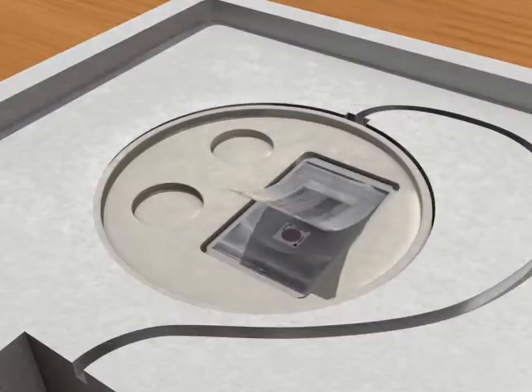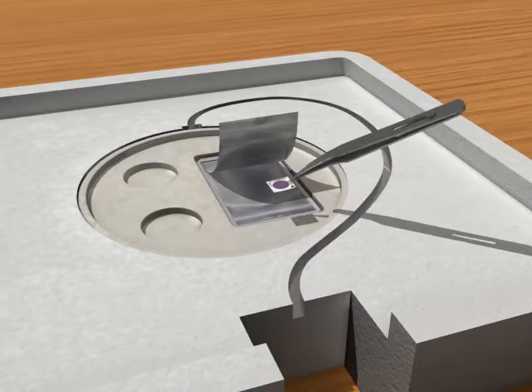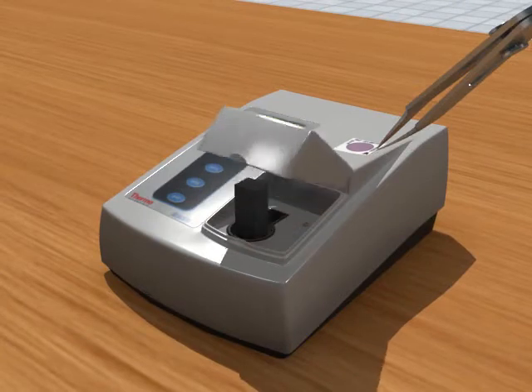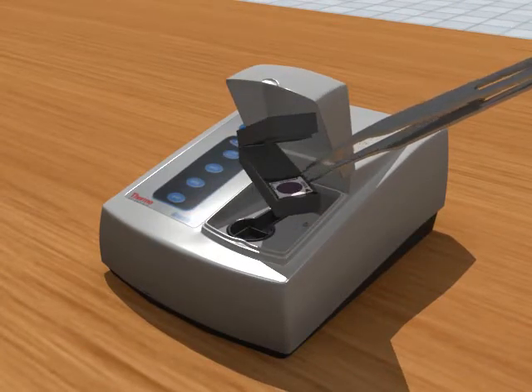When the irradiation process has been completed, the phantoms are retrieved. The response, such as optical density of the dosimeter, is measured by a suitably calibrated Genesis 20 spectrophotometer, and the absorbed dose is calculated.